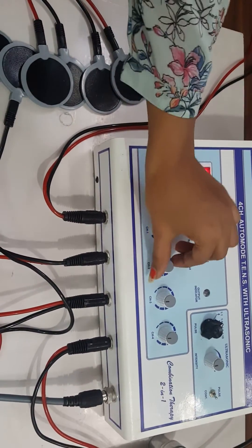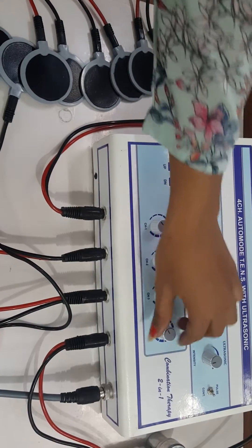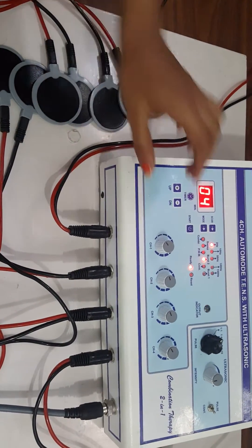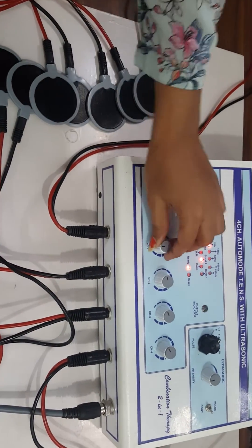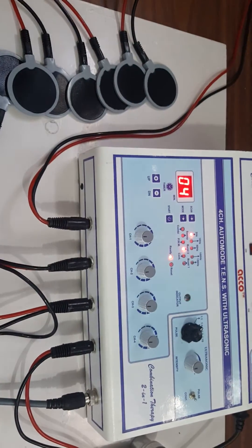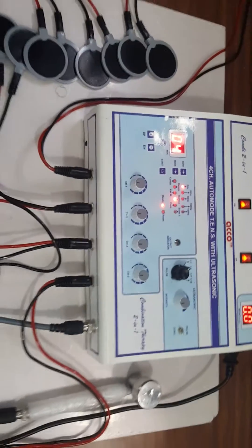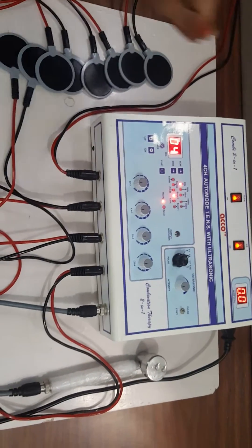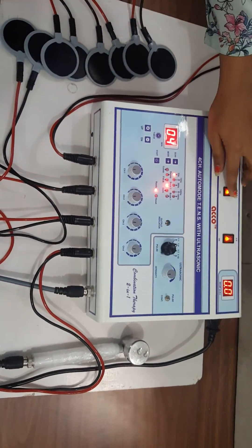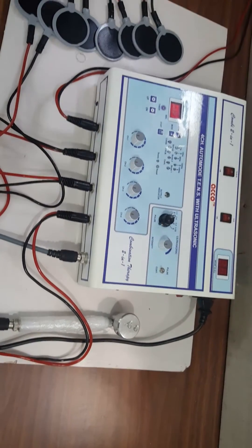Channel 1, channel 2, channel 3, channel 4 — after treatment is completed, make the intensity knob at zero. You can use both machines altogether. Once the treatment is completed, switch off the machine. The demo is completed. Thank you.